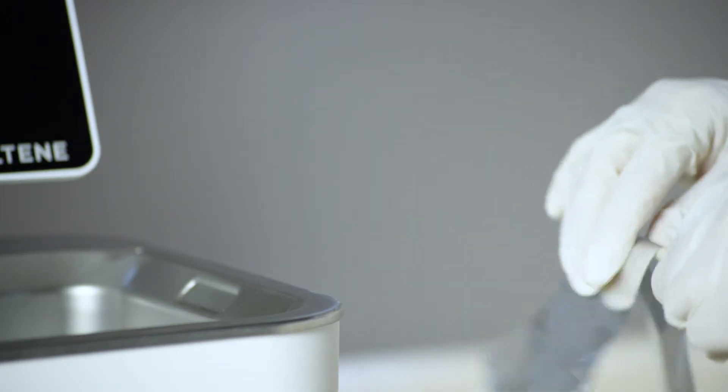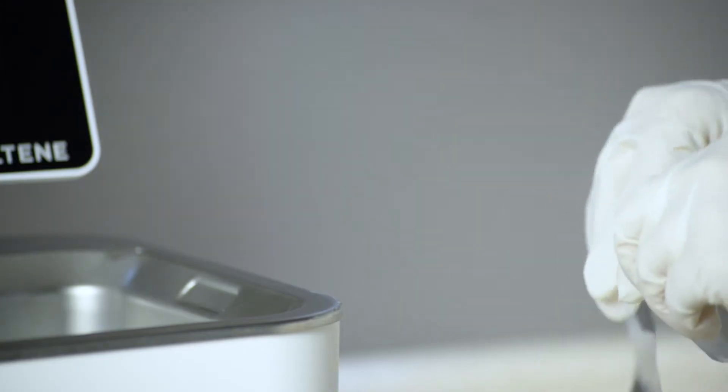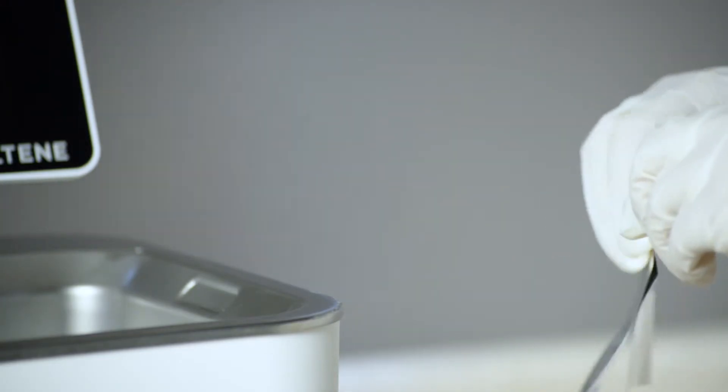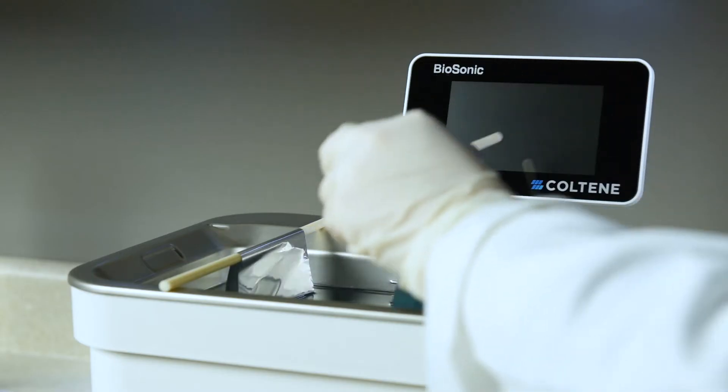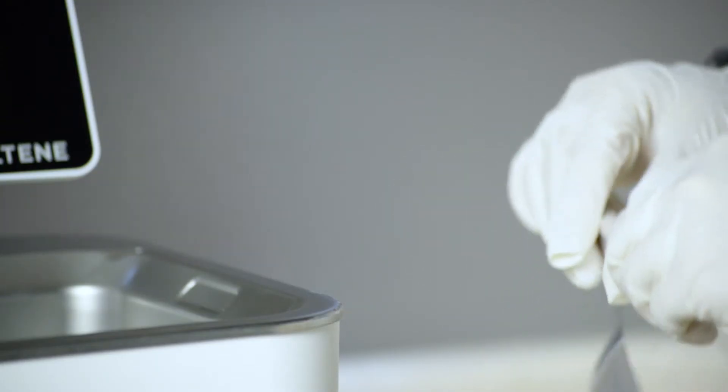Wrap a piece of foil around each rod, leaving the ends of the foil down to hang into the solution. Hang and arrange each rod evenly along the opposite edge of the tank, leaving room in between. Aluminum foil should not come in contact with the bottom or sides of the tank.